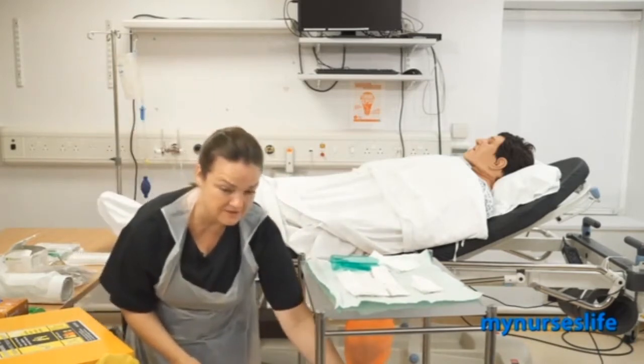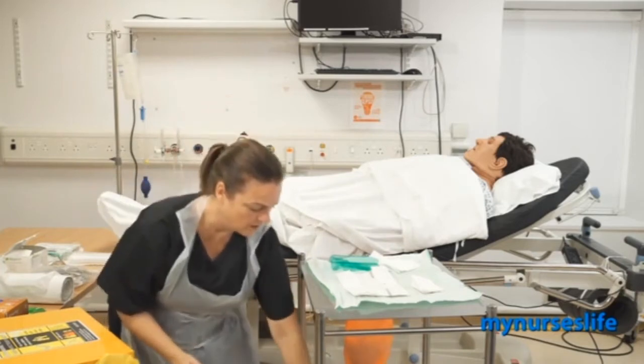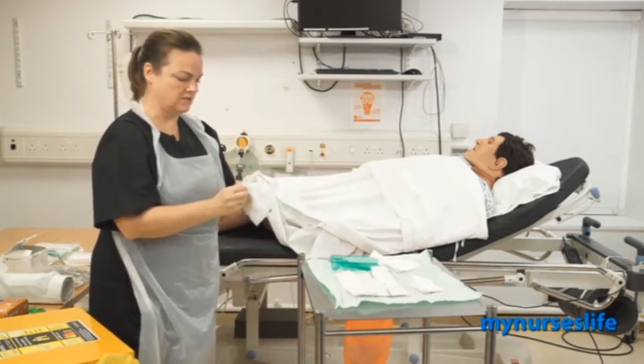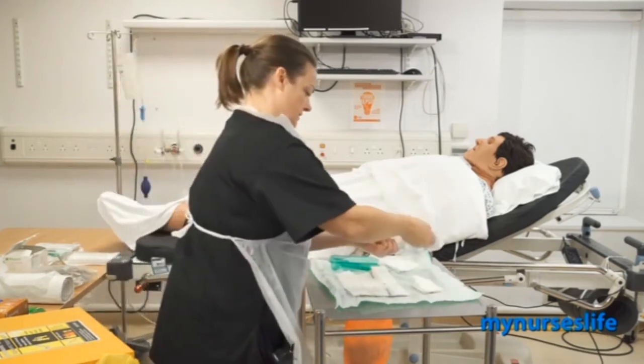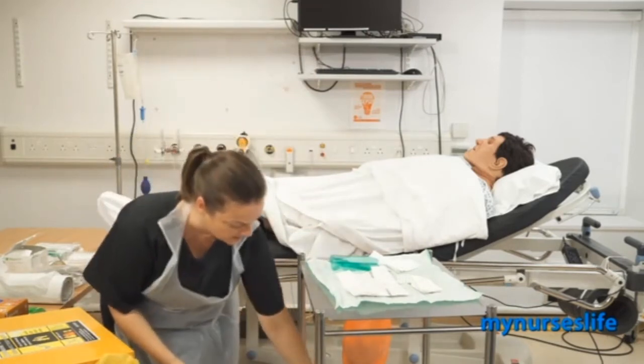Again, gel your hands. Open the dressing and put it onto the sterile field. You don't need this till the end, so you can put it out the way somewhere on the sterile field. This can either go in the bag or again, you can just pop it underneath.